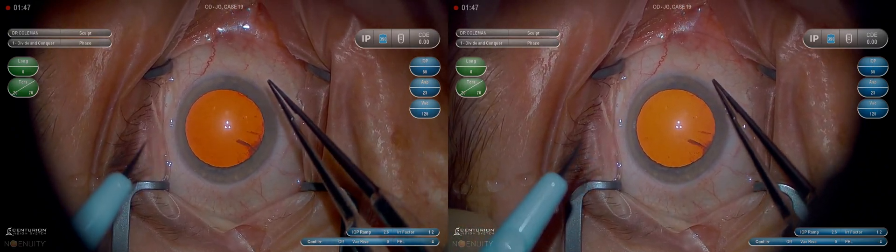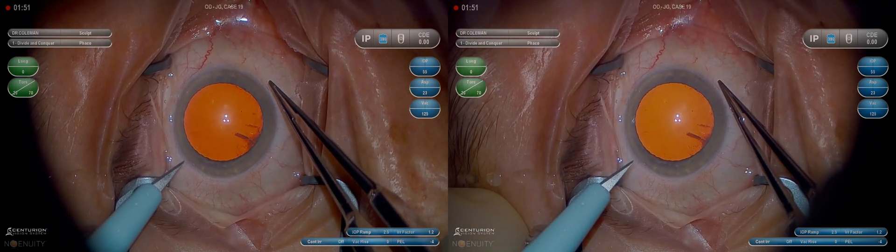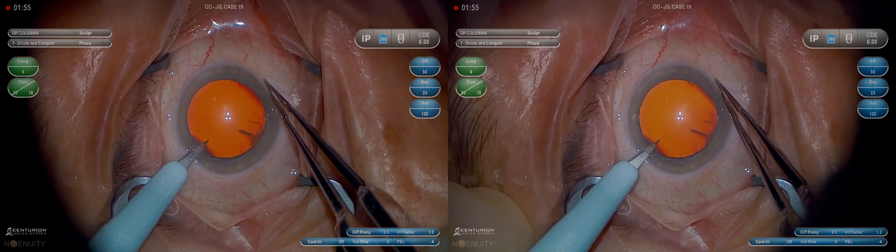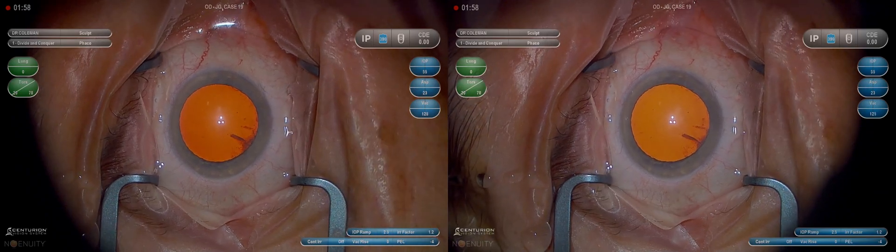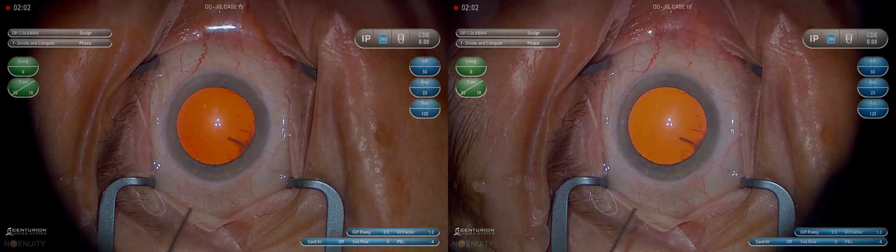We make our paracentesis with a 15-degree knife. I look at the base of the blade where it connects to the plastic to make sure it's not rotated. I want to be about 0.5 to 1 millimeters anterior to the limbus in clear cornea. Try not to nick the conjunctiva — it'll cause ballooning later in the case.